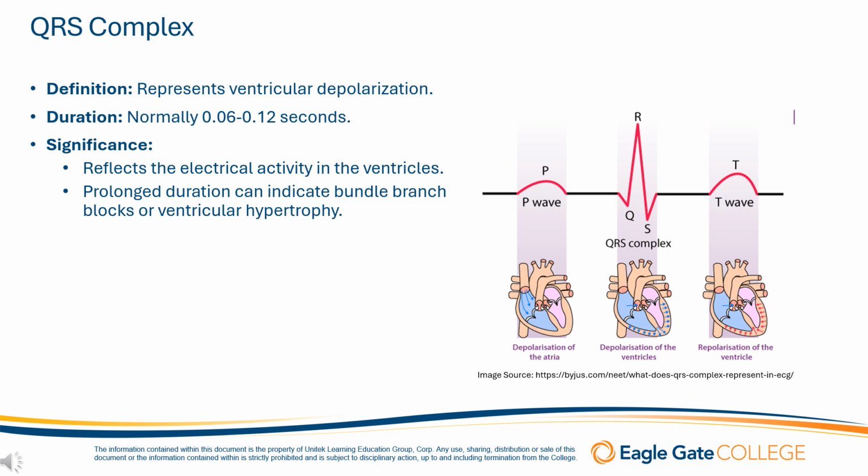And then ventricular fibrillation is when we see a chaotic, irregular rhythm with no identifiable QRS complexes. This indicates that the ventricles are just sitting there quivering. They're not effectively pumping blood. Ventricular fibrillation is a medical emergency and requires immediate medical intervention.